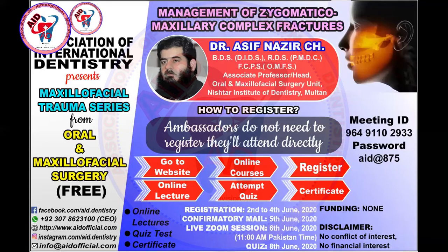Which plates should we avoid while treating a child? These mini plates we should avoid. If we want to use these, we must remove them, because in growing patients, these plates may cause a stress shielding effect, and they may also cause some growth retardation.